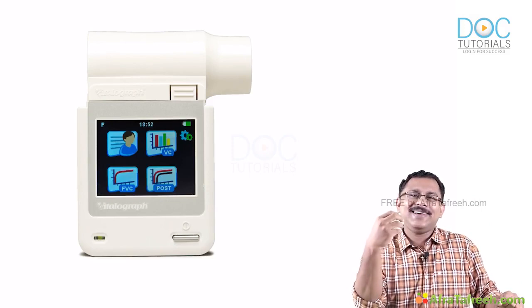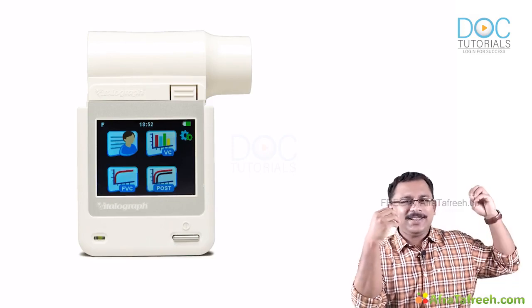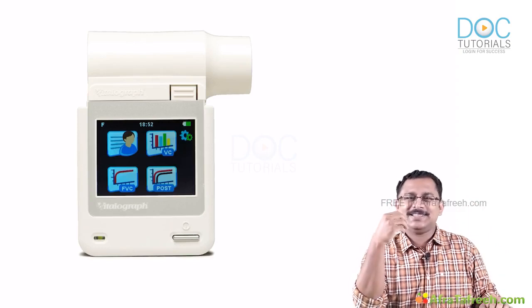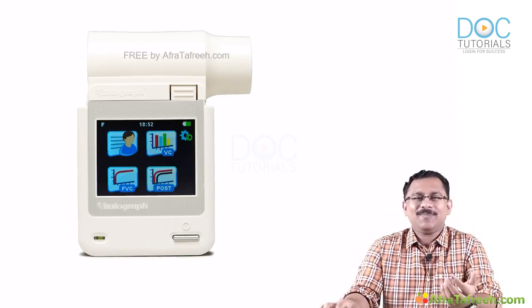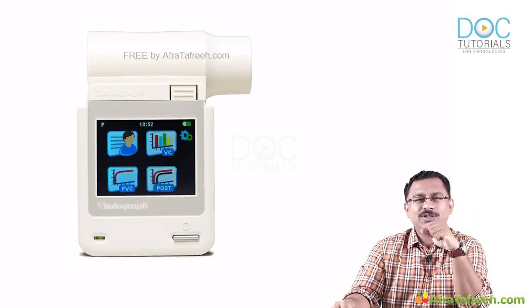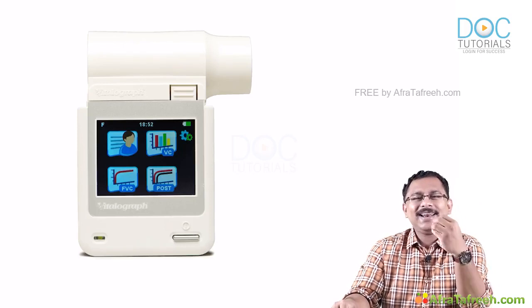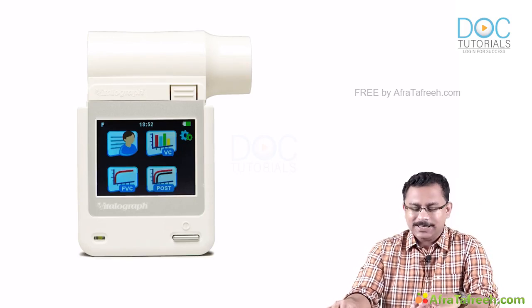Because in spirometry, you ask the patient to do a maximal inspiration and then a forceful expiration. So what is that amount? Vital capacity, correct? So you can say it is a forced vital capacity, because you are forcing out the air into the mouthpiece of the spirometer. So that is called the forced vital capacity.